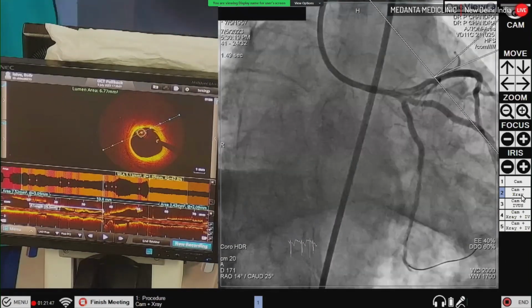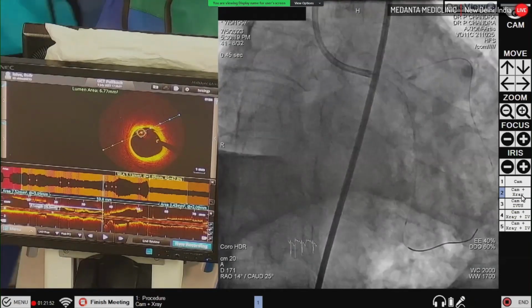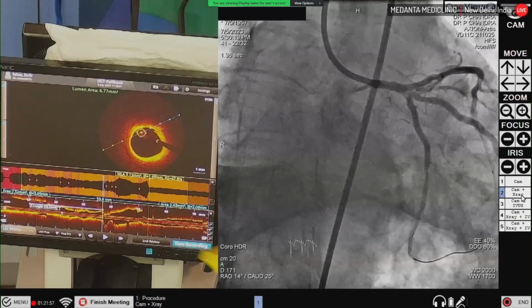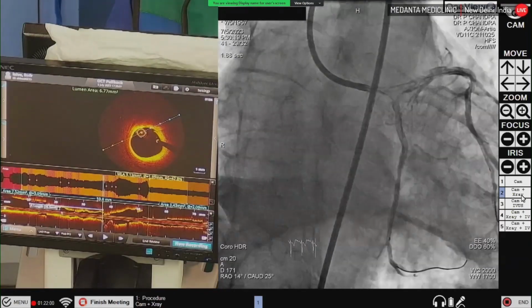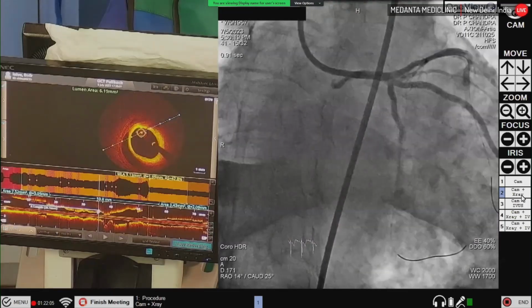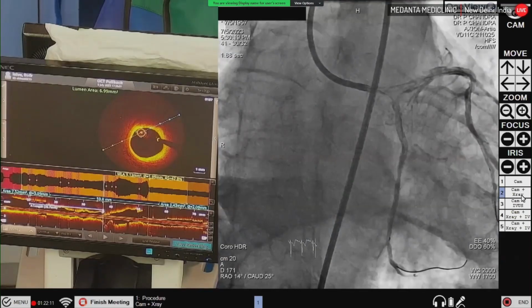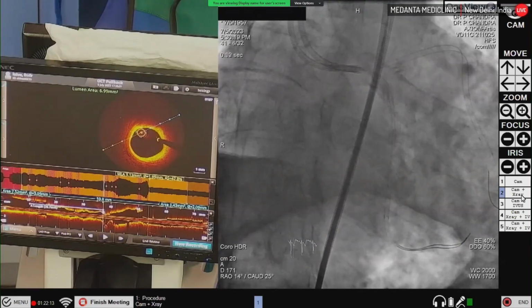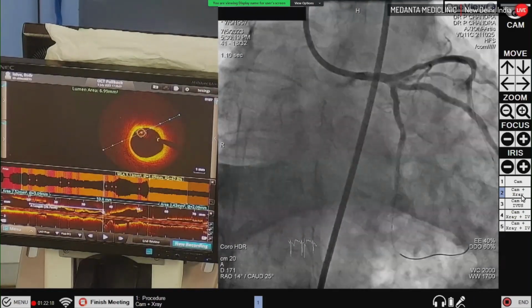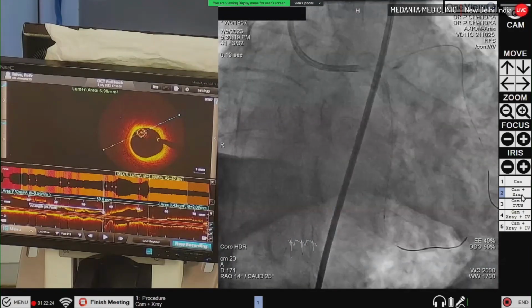Give me the stent, please. So this is something, you know, which we see at times. 26.5 length. Yeah, give it. What is that? What are you saying? The length is how much? 28. So we can take a 28 then. Give me a 28, to compress the hematoma. A 28 of anything.